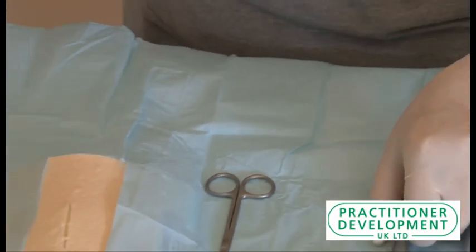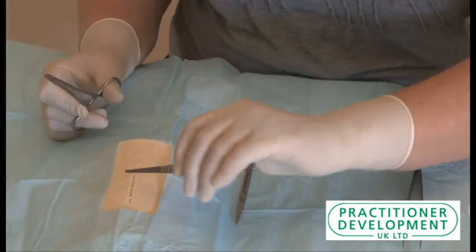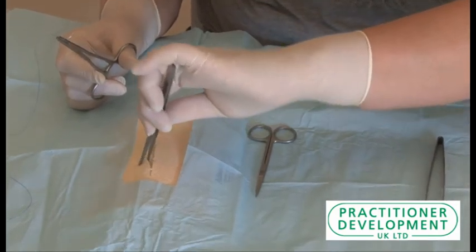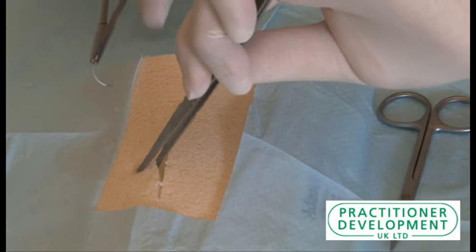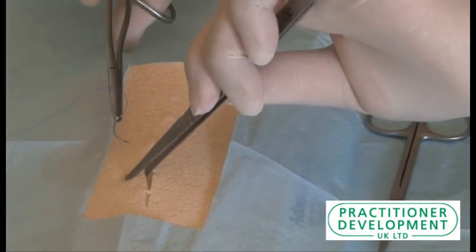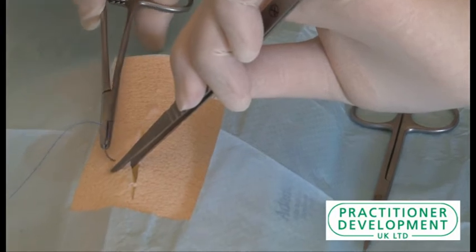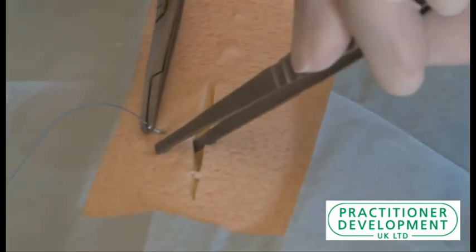We're going to use our toothed forceps and we are going to lift the skin up and put the needle at a 45 degree angle and go into the skin, letting the natural curvature of the needle guide us through.